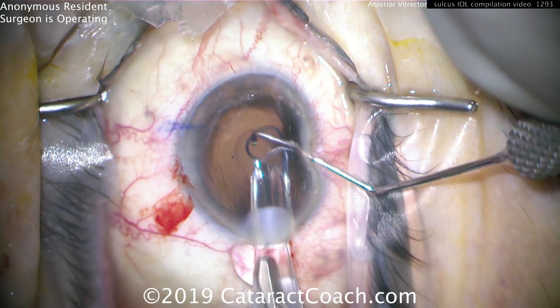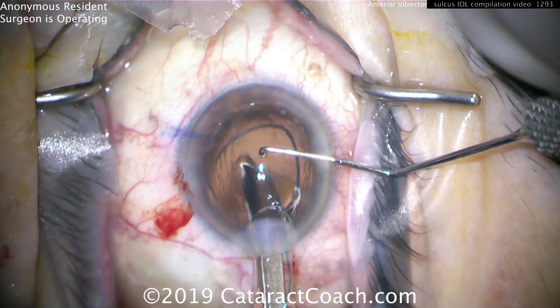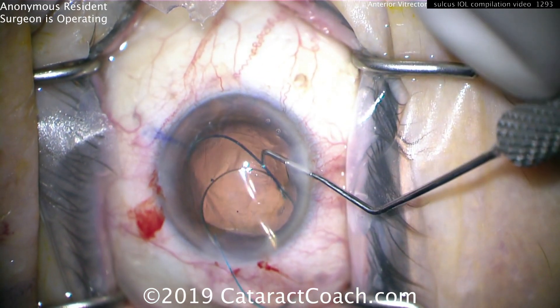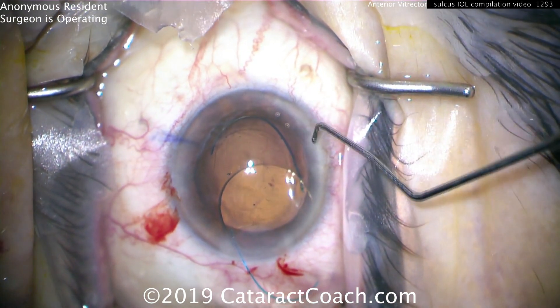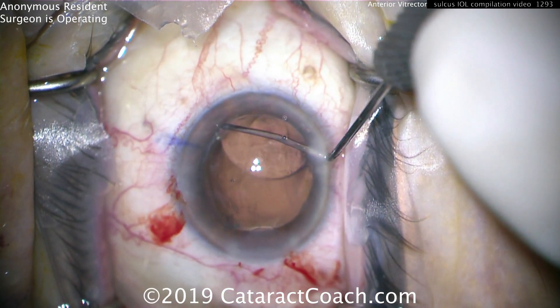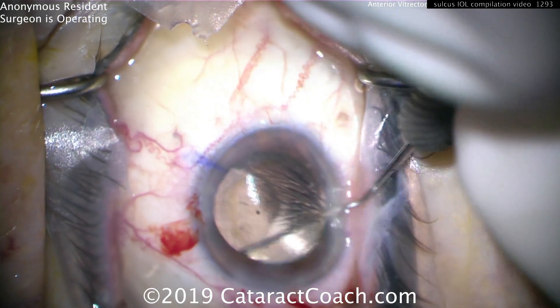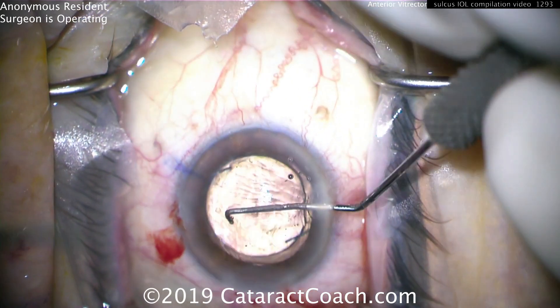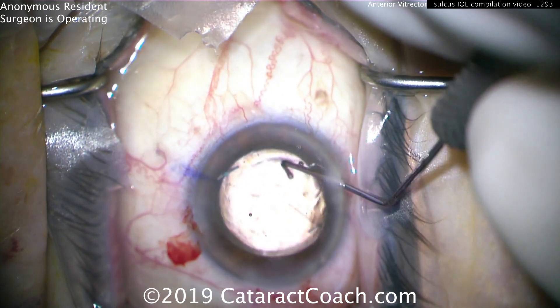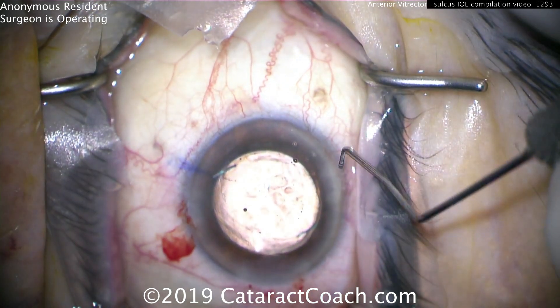Next case: another resident operating with a three-piece lens. Watch carefully — the leading haptic comes up correctly. Remember the orientation: anti-S. The first haptic looks like the number seven, and the trailing haptic should look like a capital letter L. That's the seven-L rule. There's the lens — trailing haptic correct orientation, gently dialed into the sulcus. A little dollop of cohesive viscoelastic can help open up the sulcus. If the lens optic stays in the sulcus, use sulcus power with the rule of nines after adjusting for A-constant. If you're doing optic capture with haptics in the sulcus and optic behind the rhexis, use in-the-bag power and just change for the A-constant.